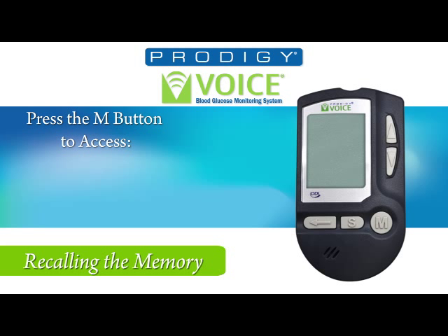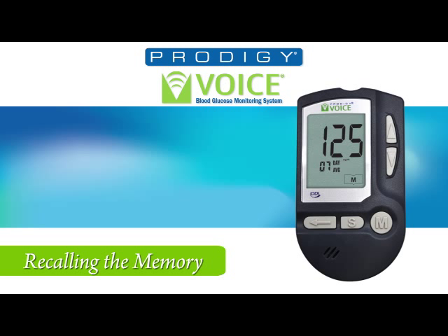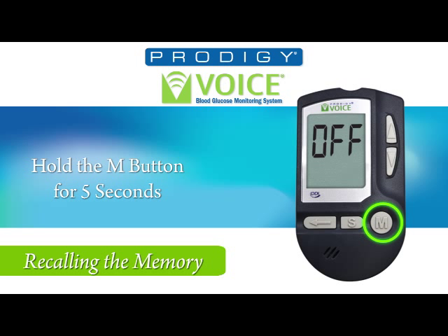Reviewing average test results: press the M button while the meter is off. You will hear: 'Your Prodigy Meter is on.' The meter then reports the date and time. Press and hold the M button for 2 seconds. Now you will hear: '7-day average, 125 milligrams per deciliter.' To hear other average test results, use the up and down buttons. To exit, press and hold the M button for 5 seconds, or leave the meter alone for 2 minutes and it will turn off automatically. Goodbye.